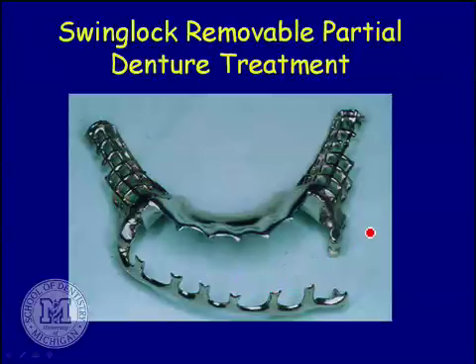Now, I don't use these all that much anymore. We used to do them a little bit in the old days, but I think pretty much now with high-speed instrumentation, you can reshape the contour of teeth fairly easily. And with bonded composite restorations without crowning teeth, you can also build up undercuts more where you need them.